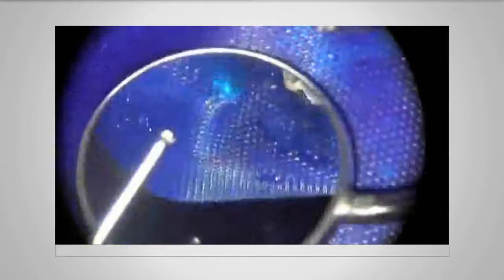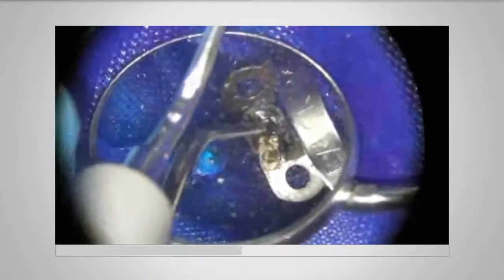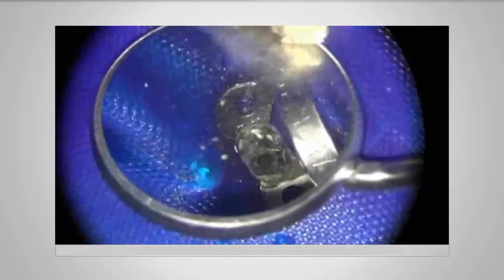So this is a cast post in the lateral incisor. I've made a little notch in the palatal aspect. I've taken my number 4 Startex ultrasonic tip and I'm vibrating it, and you can do that for about 30-40 seconds. I would use the water spray because it can get hot without it, and that should disrupt the cement lute and allow removal of the post.